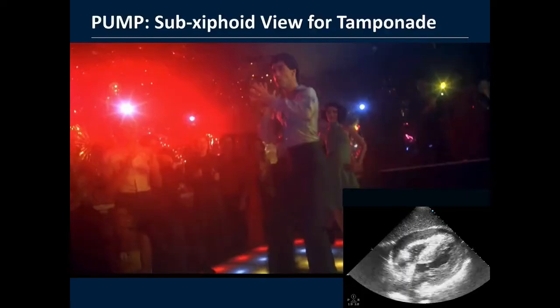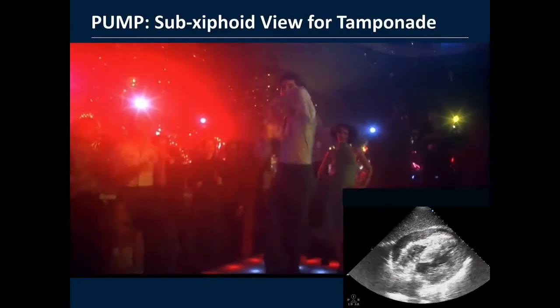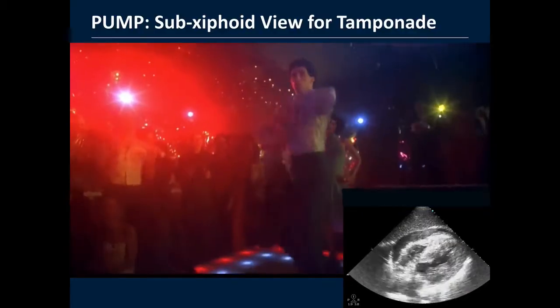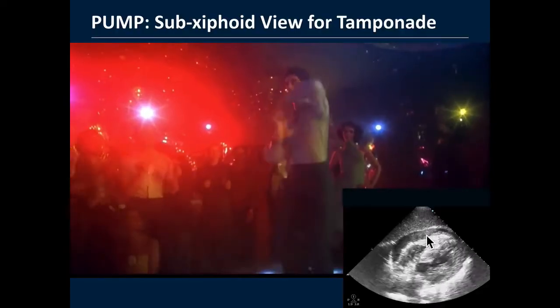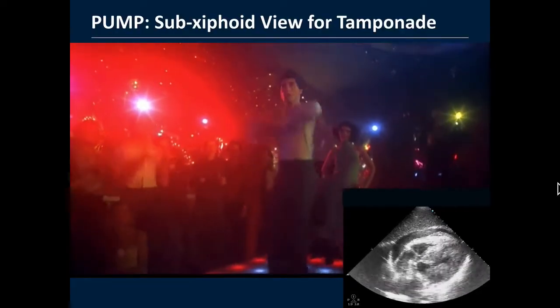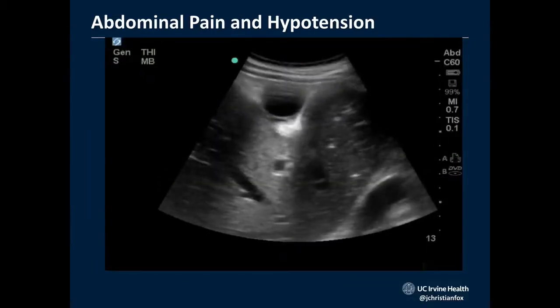But the thing that reminds me of this is John Travolta. Check this out. Look at John Travolta. It's like when he made this movie, Saturday Night Fever, back in the 70s. It was like he was thinking about tamponade doing that move right there. I mean, it's really kind of this thing right here, isn't it? So if you see that, start to elevate the level of the panic, so to speak.